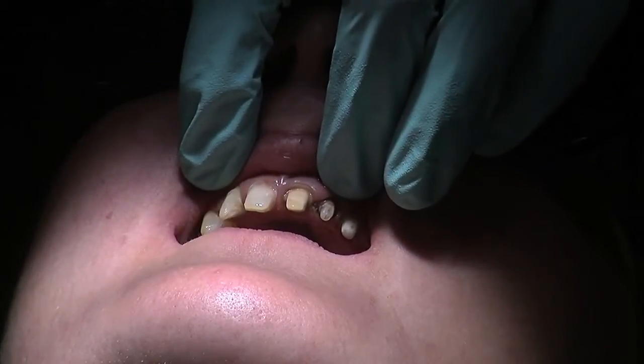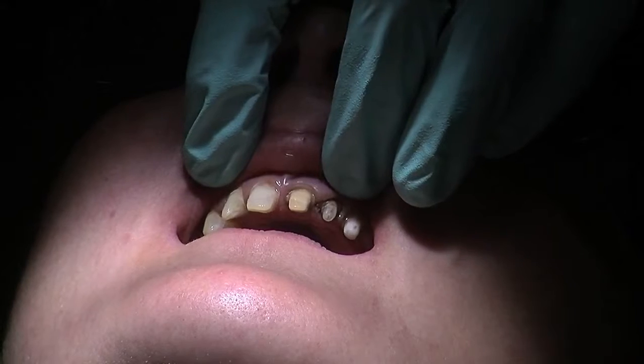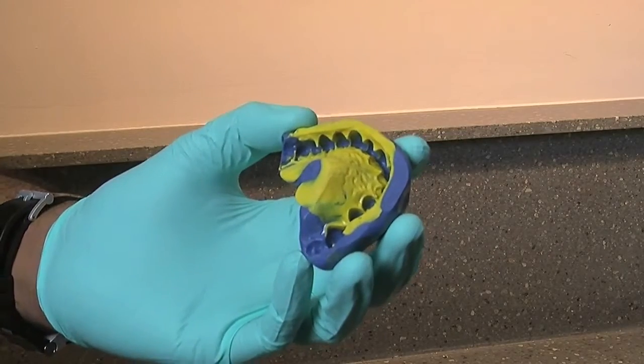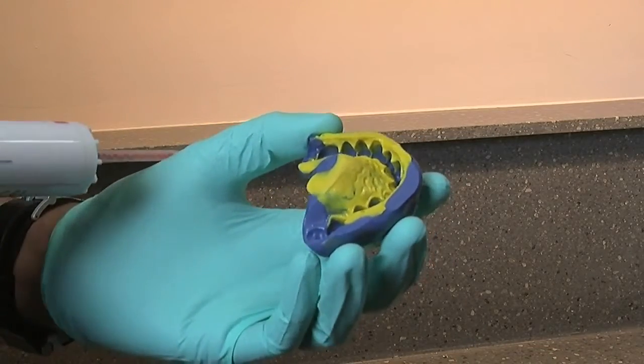I'm going to gently blow dry this as well. Leave that on for 10-15 seconds and then we're going to light cure for about 20 seconds each. Okay, let's go. So I'm just going to demonstrate the introduction of the Luxatemp Star material into the putty index as we do the temporaries, the trial smile.